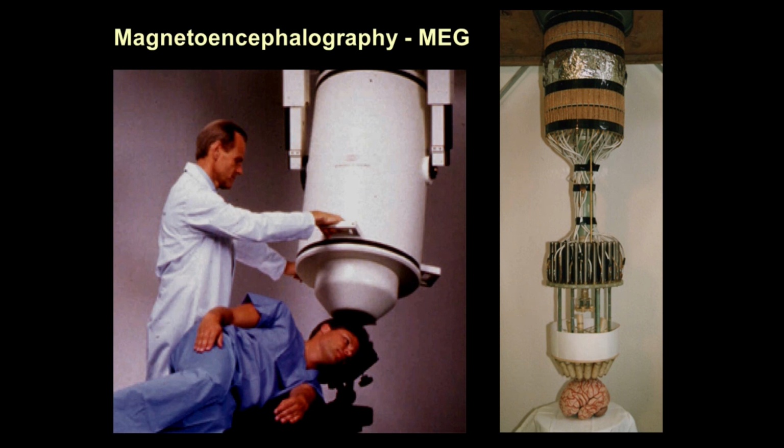Now, something that is very good is EEG, either scalp or implanted, or MEG, or magnetoencephalography. Now, MEG is a scarce tool, but quite good for some of these cases, particularly the lateral or neocortical epilepsies, where what we do here is we actually record extracranially the magnetic fields that are inherent.